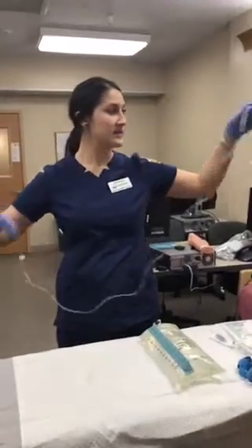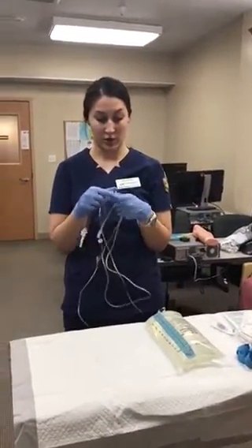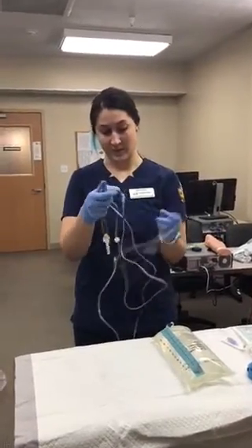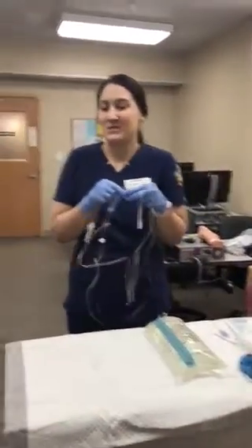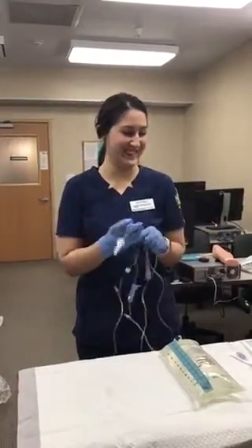So the next thing I'm going to do is close my roller clamp, and that just helps prevent us from having a mess. Again, I'm going to go ahead and do this secondary safety just because sometimes stuff breaks. Getting kind of used to that.